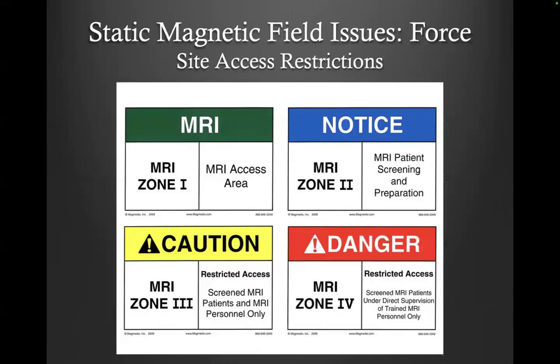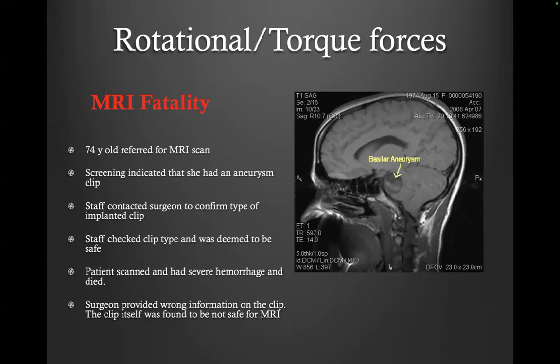That's actually why we take it very seriously at our imaging center. If you have any implanted devices, we cannot just take your word for it. All implants should have an implant card, which shows the device, the name and manufacturer, as well as the model name. Then we can check this safety information.